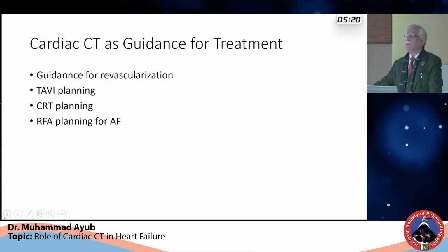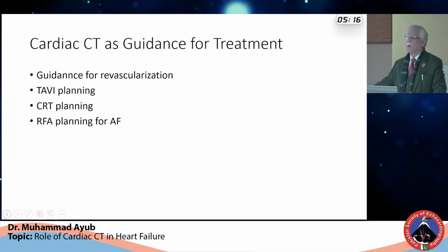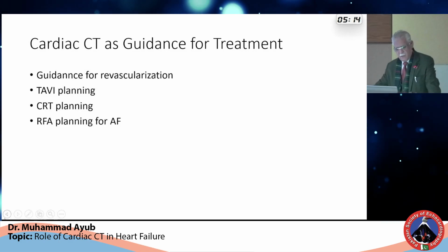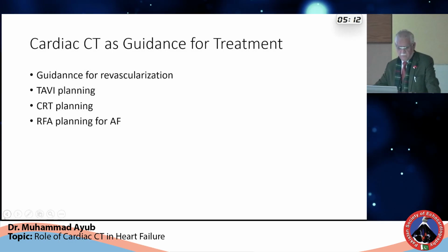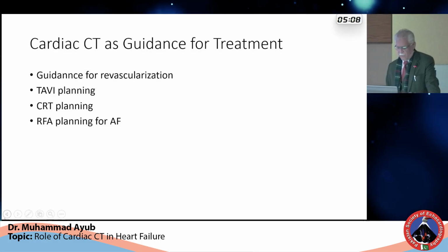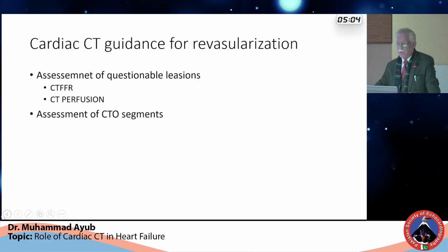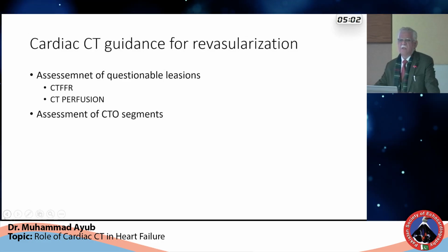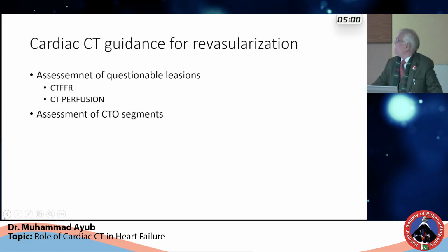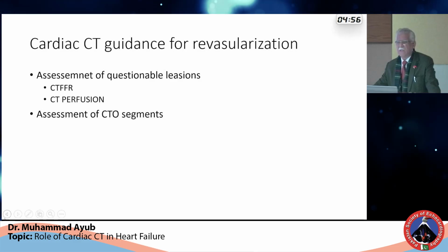Similarly, cardiac CT is a good tool for planning of treatment. Like it is a mandatory tool for TAVI planning, for CRT planning, and for radiofrequency ablation for atrial fibrillation. In patients with coronary artery disease and questionable lesions, CT-FFR is very helpful for defining the significance of any lesion.